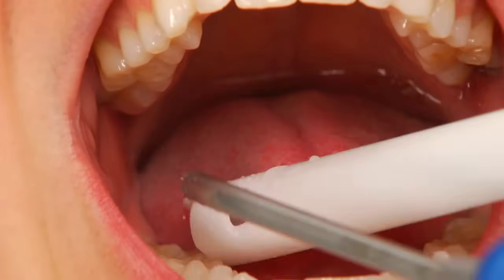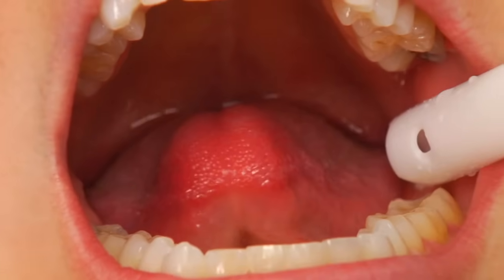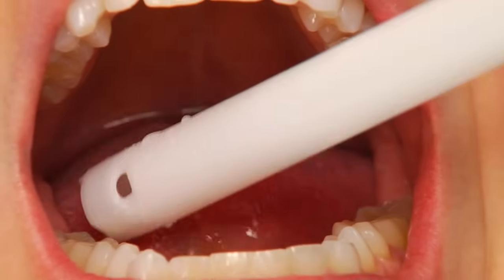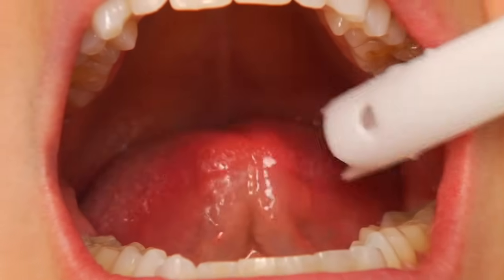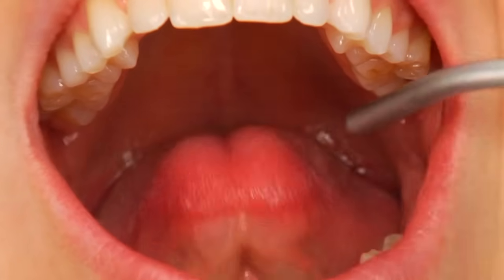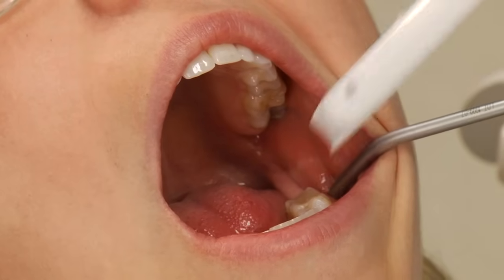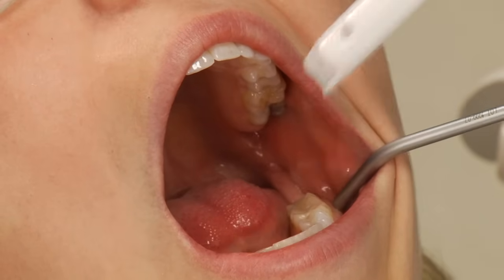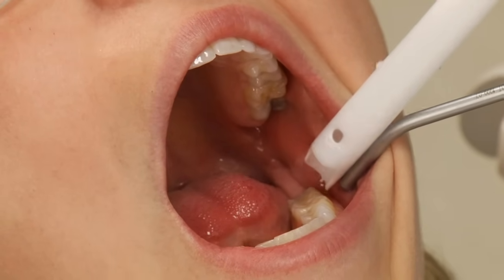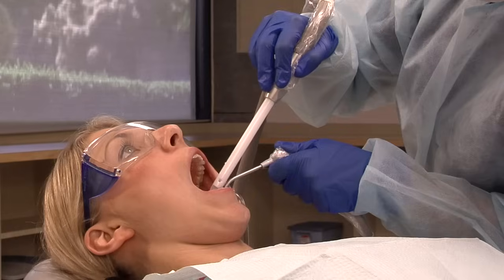After a few seconds of rinsing, discontinue spraying the water and collect what has pooled in the corners of the patient's mouth. Again, avoid touching the middle or back areas of the patient's tongue. Use the air-water syringe tip to retract the cheeks, which will create a clear vision of the area and eliminate the tendencies to suction the soft tissues of the cheeks, lip, and tongue.